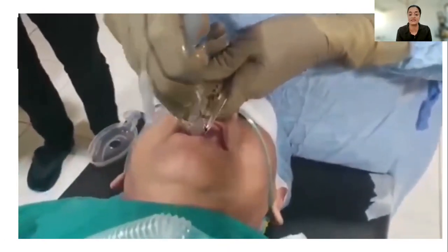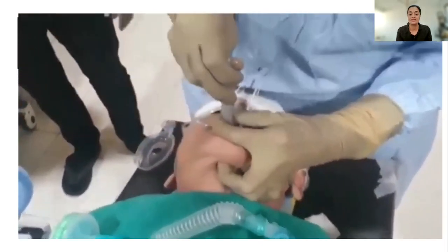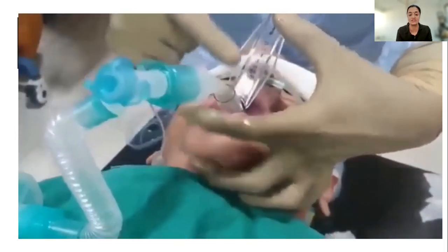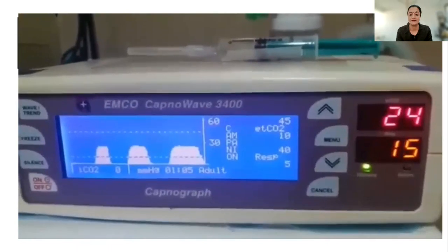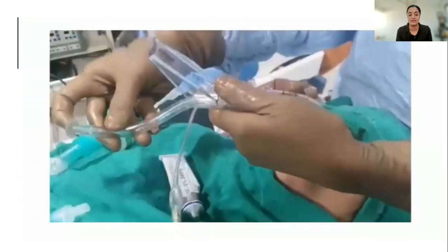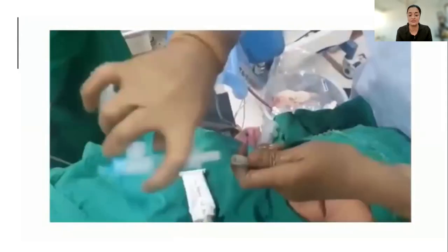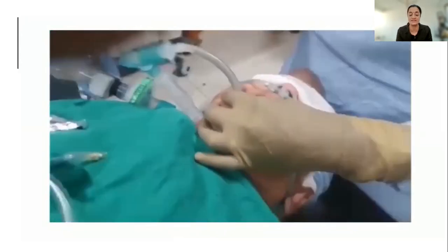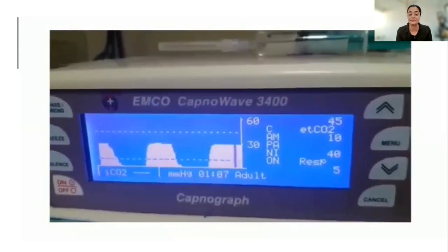A well-lubricated reinforced tube that comes along with the set is passed beyond the LMA into the vocal cords. The universal connector is attached and placement is confirmed using the capnograph and auscultation — dual confirmation. Using the stabilizing rod, the endotracheal tube is kept in place while the LMA is removed. Connection is re-established and dual confirmation via auscultation and capnograph confirms placement of the endotracheal tube.